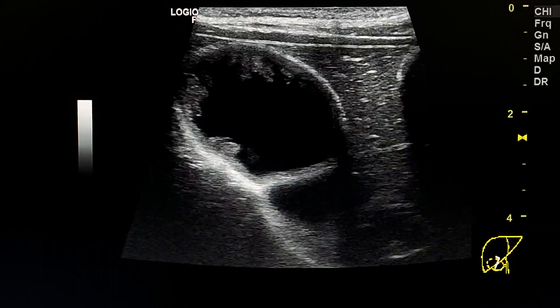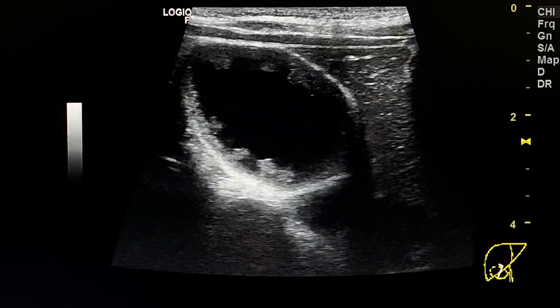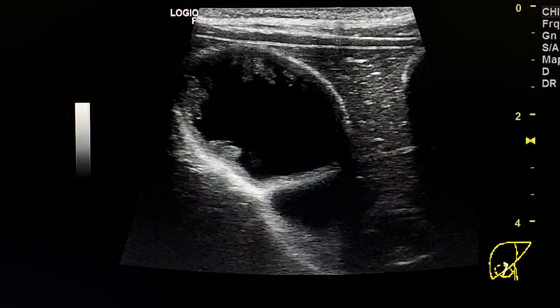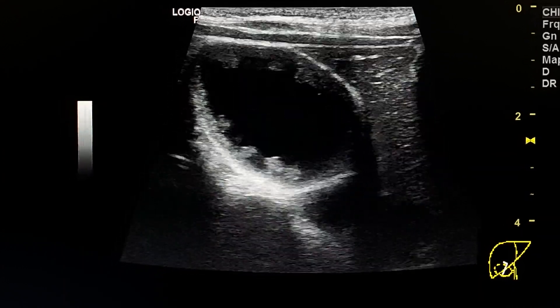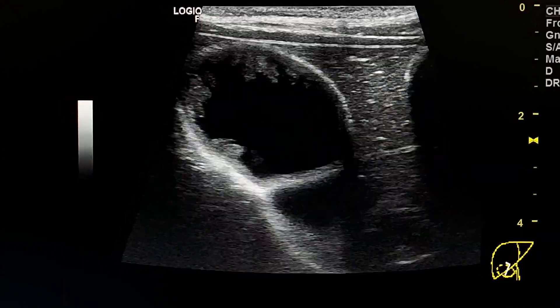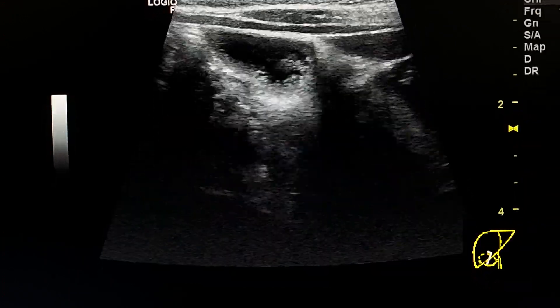This is the gallbladder. We see multiple polyps in the wall with varying sizes.